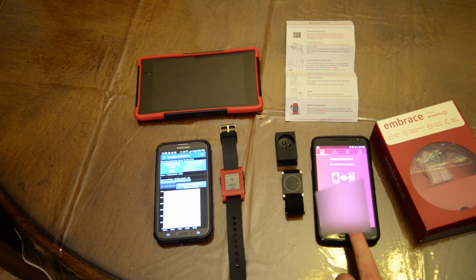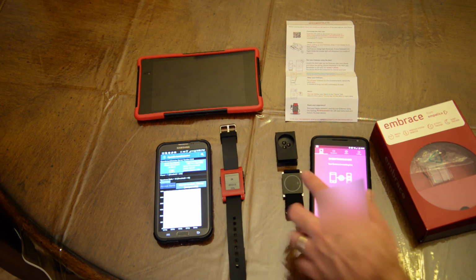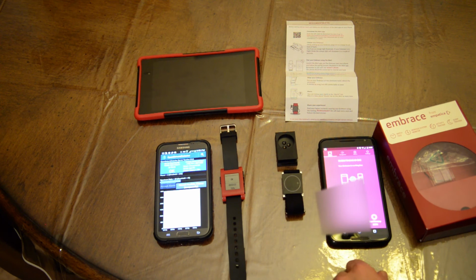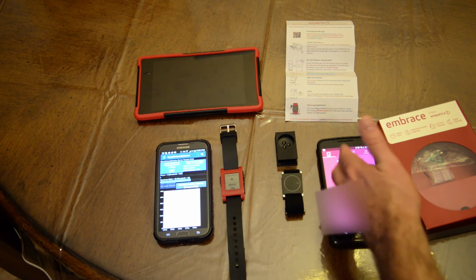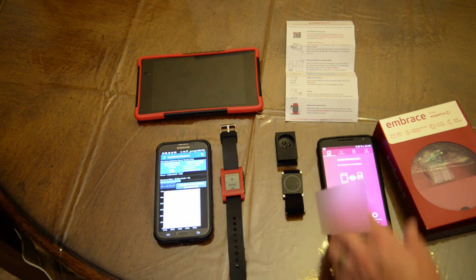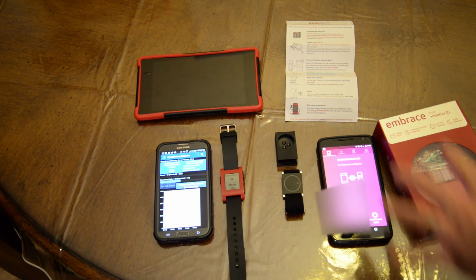It doesn't have GPS, but you know what? You probably don't need GPS for this device. If the phone's on your son or daughter, you don't really need GPS on this watch. Why? Well, because the phone has GPS. If you have something like Cerberus, which I highly recommend, you could track your son or daughter in Cerberus and get an actual location on the map. So you'll be able to track your son or daughter to the location where he or she might be having a seizure. So there's a real plus to that.